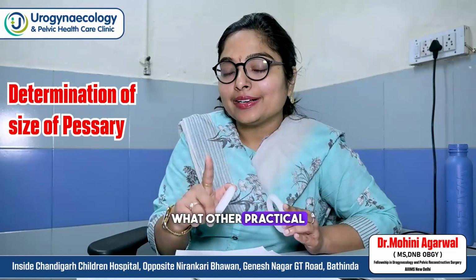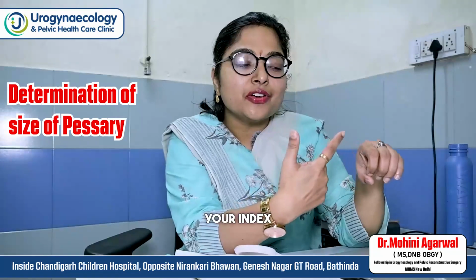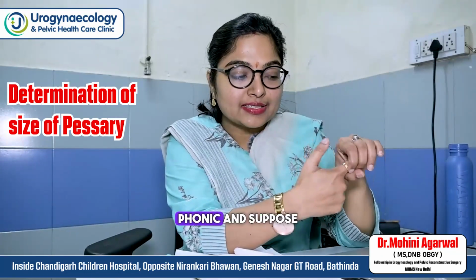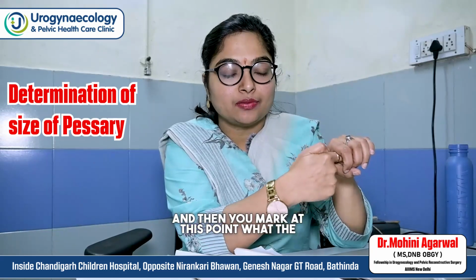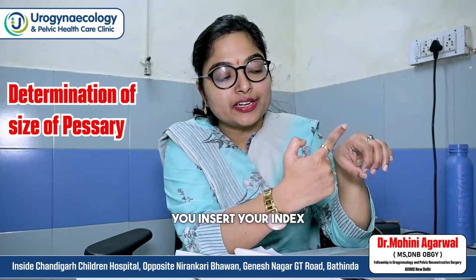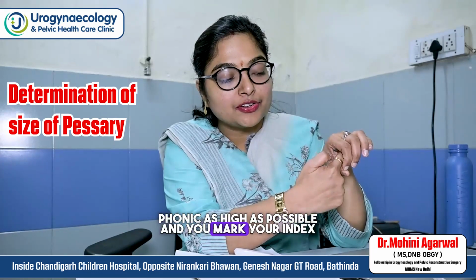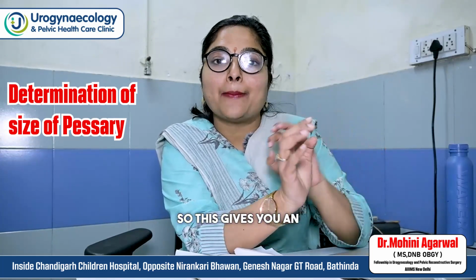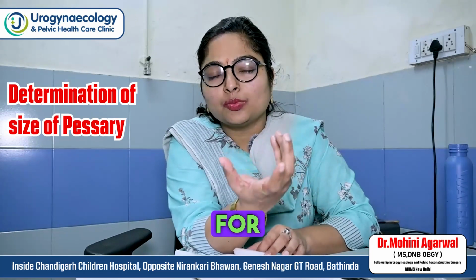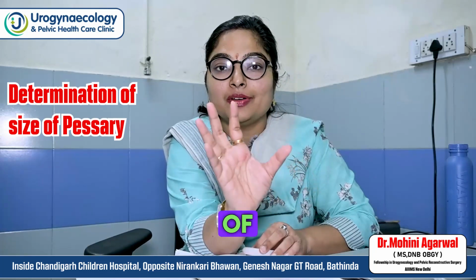Another practical method for sizing the pessary is to insert your index finger in the posterior fornix as high as possible, and mark your index finger where it touches the pubic symphysis. This gives you an approximate idea. For the bony part, you can subtract 0.5, and that will give you an approximate idea of the pessary size.